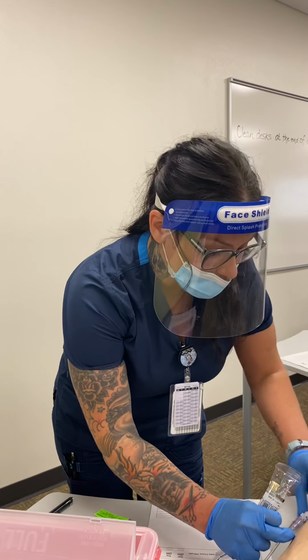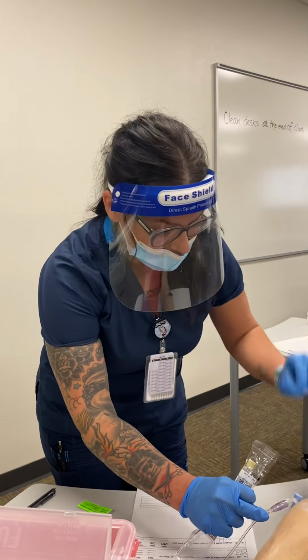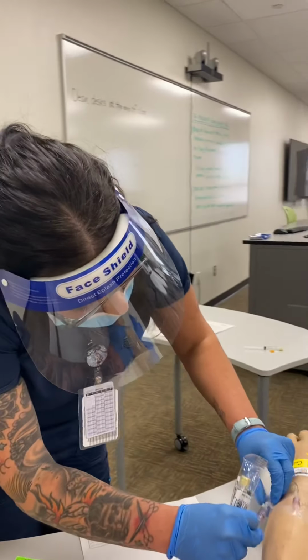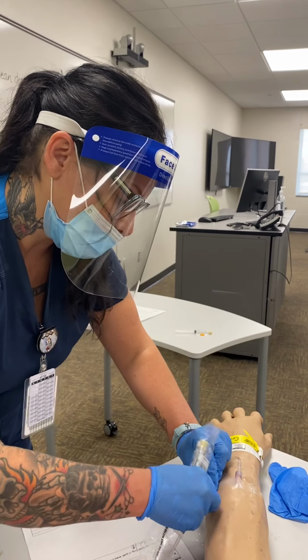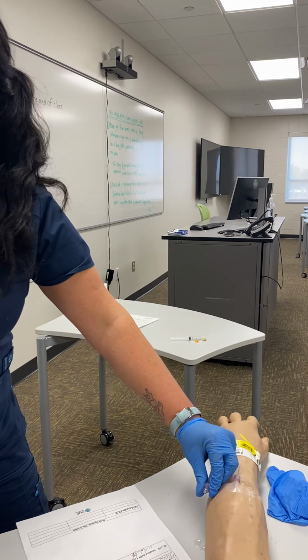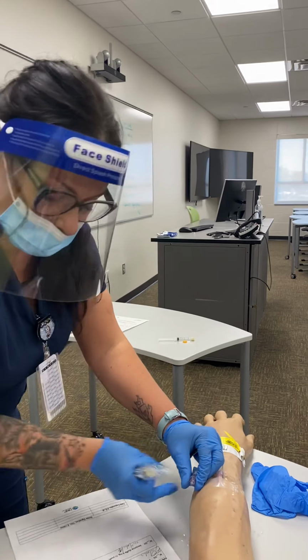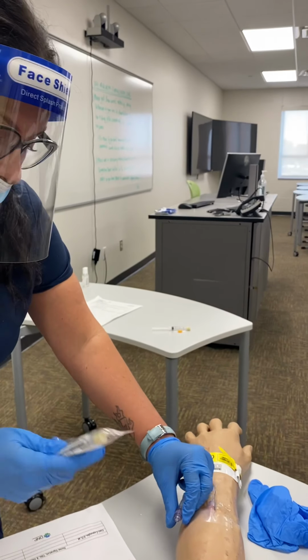I would have opened that lock before I started my infusion, so that was open. And okay, I'm just going to go ahead and open. Hang that for a minute, clean the port, 15 seconds, allow it to dry.